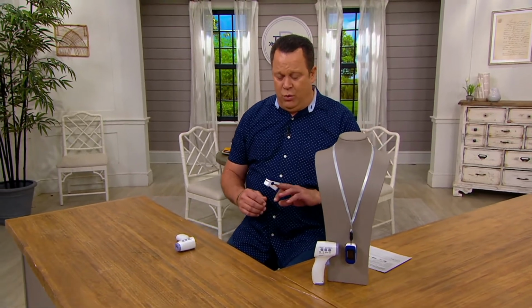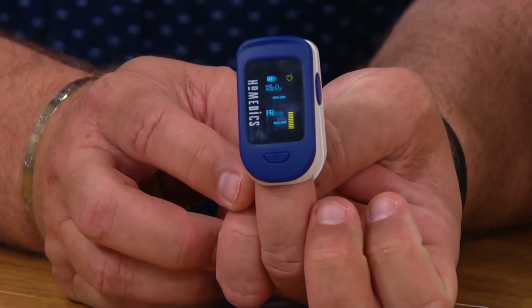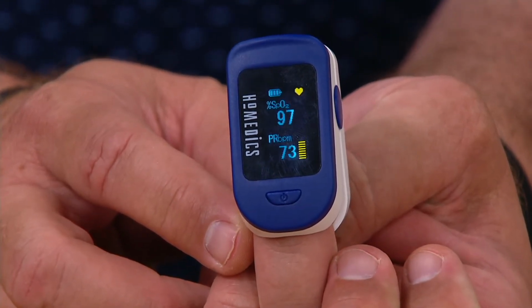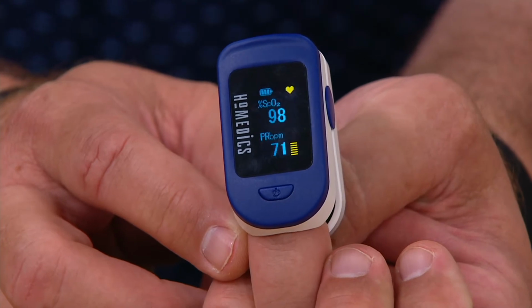Now, we're learning a lot about those numbers here in the last year, year and a half. And a lot of you are wondering, well, what is normal? I'm probably not choosing a very appropriate finger there, am I? All right, let me try the ring finger here. All right, now, the bottom number is going to be my heart rate. The top number is going to be my blood oxygen saturation level. 95 to 100 is considered normal. Now, my heart rate is a bit high because I'm on television and rushing around.